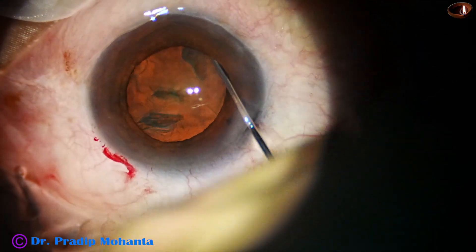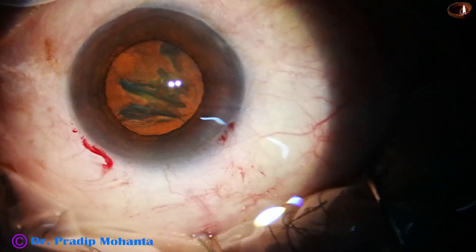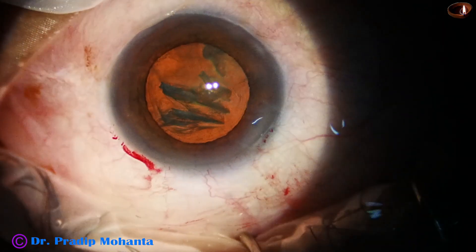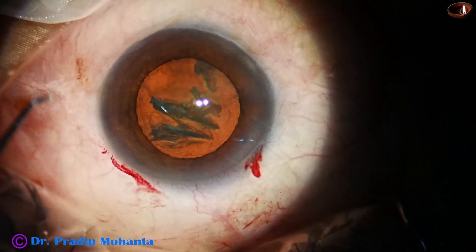Now, hydrodissection is done with BSS. And this is visco filling up the anterior chamber.